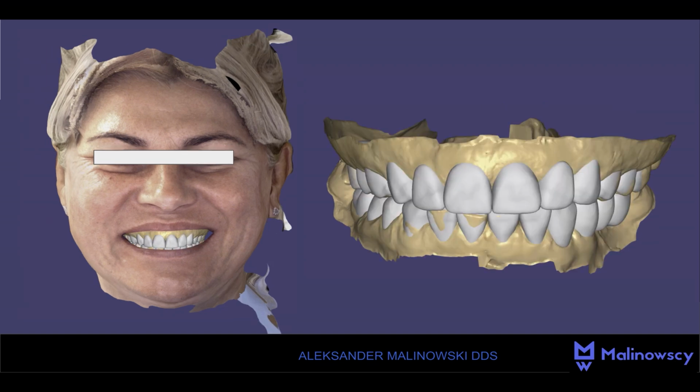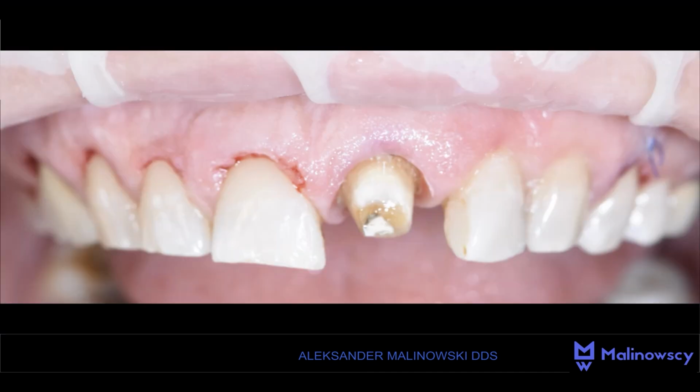Here you can see the project in 3D form at this stage. It must already be prepared in full occlusion and its aesthetic shape. It's a great time to call the patient back to get the final acceptance. Usually, we discuss this stage online. At the preliminary stage, I also removed the old crown and made a temporary one from structural material.